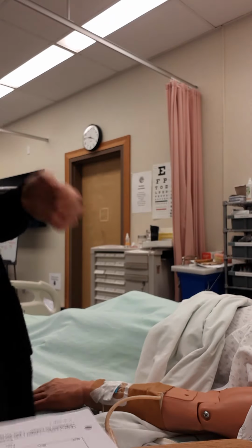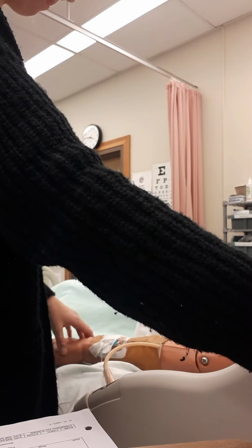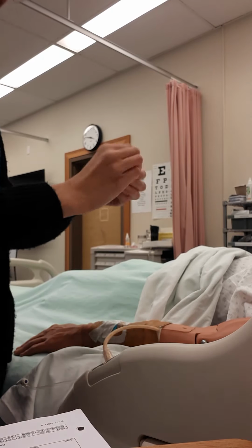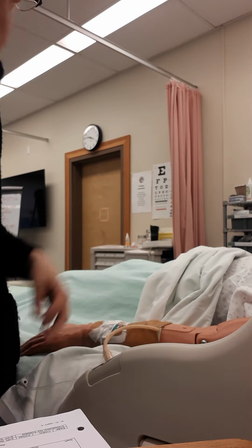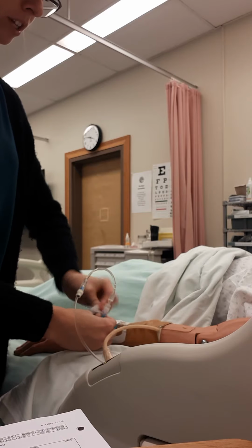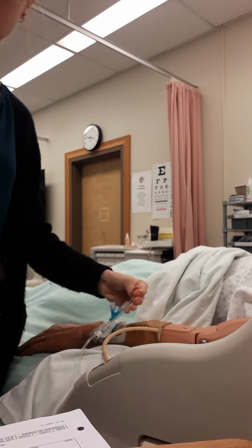So I'm going to make sure that bed is raised to a good height for me. And I'm going to start by, if her infusion was running, I would clamp it. And I'm going to clean the port for 30 seconds. For the purpose of the video, we'll say that was 30 seconds. I'm going to clamp it there as well.